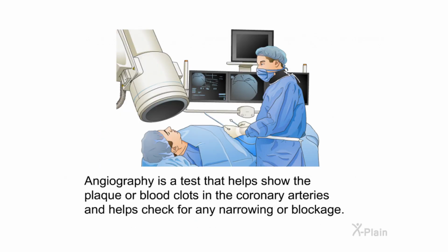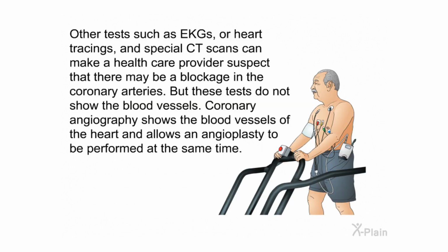Angiography is a test that helps show the plaque or blood clots in the coronary arteries and helps check for any narrowing or blockage. Other tests such as EKGs or heart tracings and special CT scans can make a healthcare provider suspect that there may be a blockage in the coronary arteries, but these tests do not show the blood vessels. Coronary angiography shows the blood vessels of the heart and allows an angioplasty to be performed at the same time.